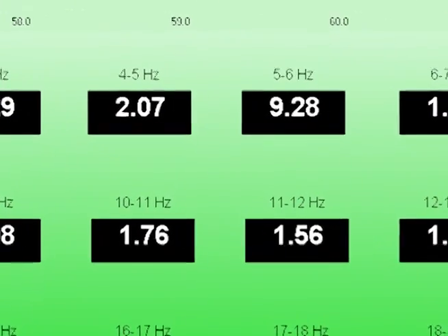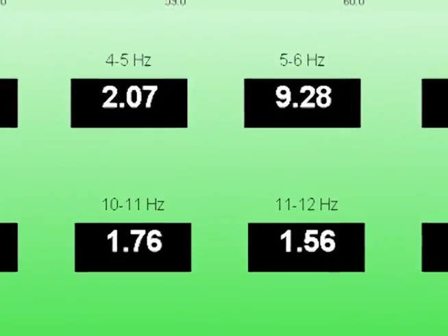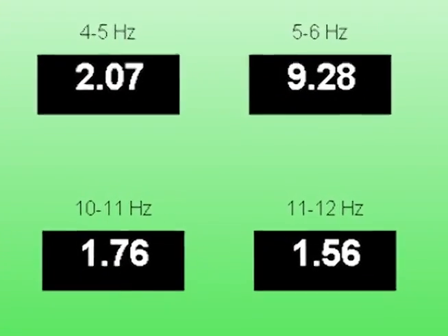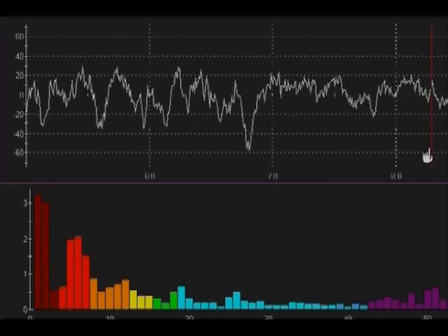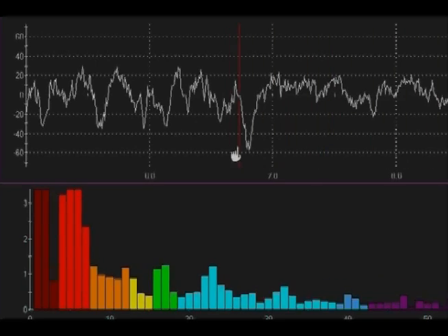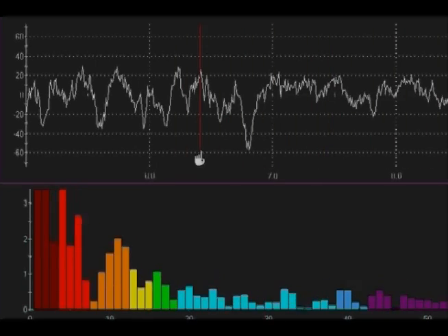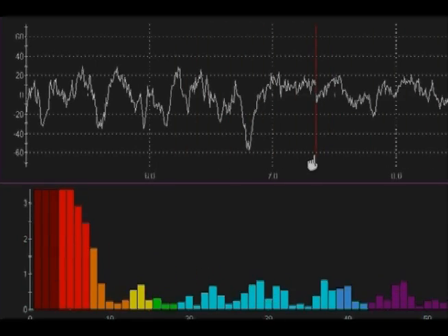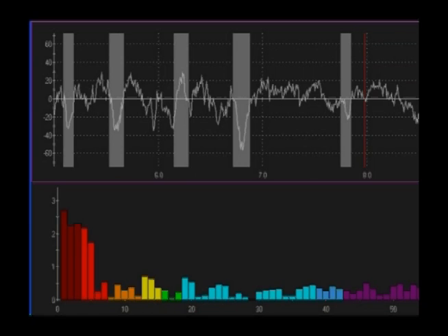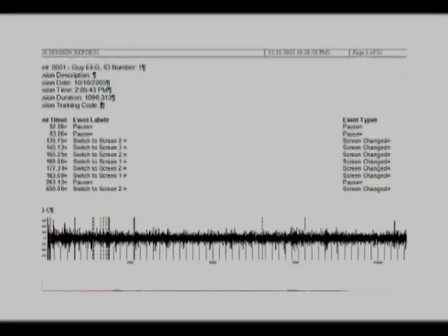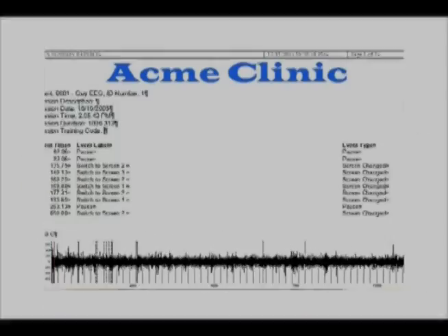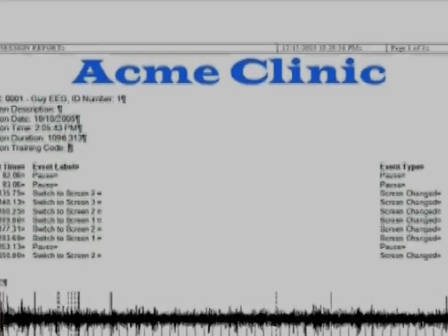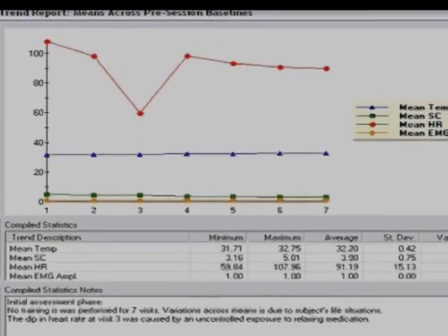Biograph Infinity offers a variety of ways to review and report on your data. Using report screens, easily correlate all the data at any given point in time with our red line guide mark. Choose manual or automatic artifact rejection, or view or print just statistics, or print a report with your own customized header, or show a trend report.